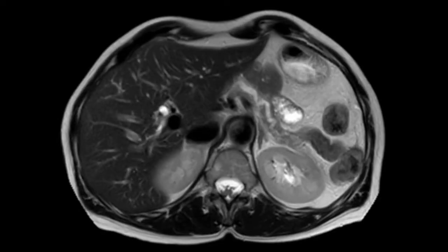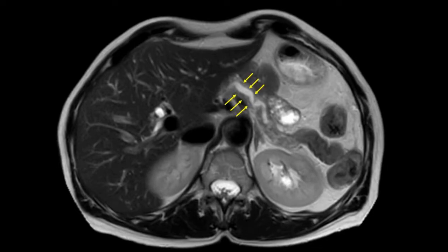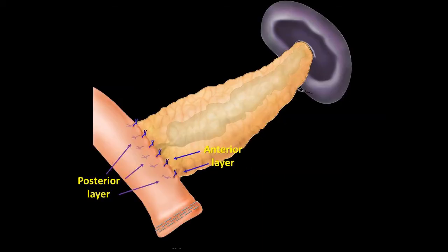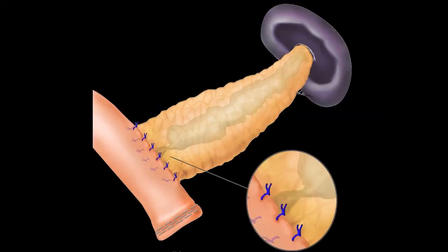MRI showed a complete stenosis of the pancreatic jejunostomy with pronounced dilation of the main pancreatic duct. In a closer look, we can see the anastomotic stricture.